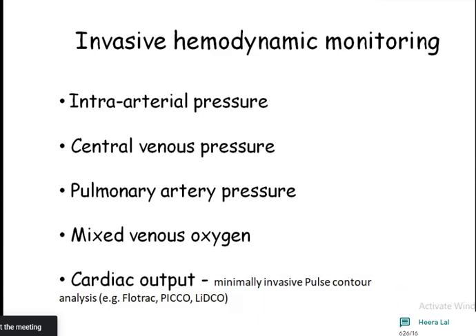Invasive hemodynamic monitoring includes intra-arterial pressure monitoring. So what is intra-arterial pressure monitoring? That is invasive arterial monitoring. Through the BP cuff, we were doing it non-invasively. Now we will be inserting an arterial cannula, and we will be directly measuring the blood pressure through that cannula.